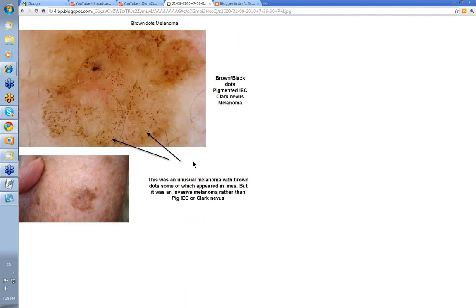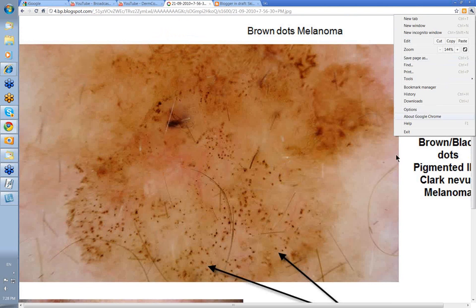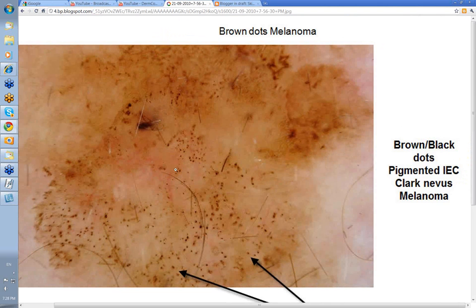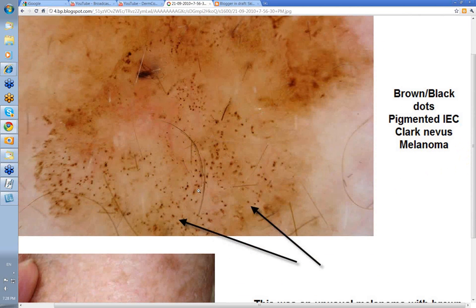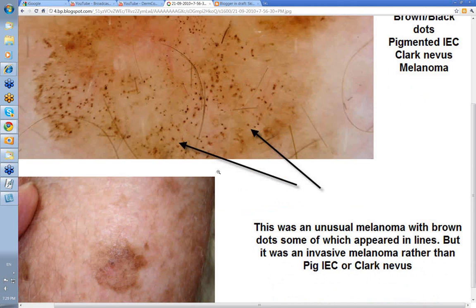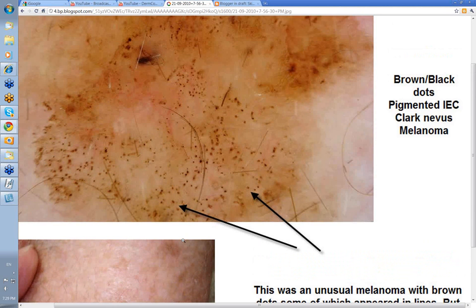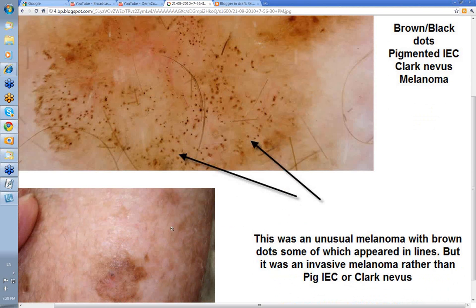Melanoma with grey dots — not normally brown dots. Excuse me. There were a lot of brown dots in this lesion. Some of these looked as if they might be in lines, and hence you'd think of a pigmented IEC. But there are varying sizes to these dots. Sometimes brown dots scattered like this can be a feature of a melanoma, as it was in this particular case.